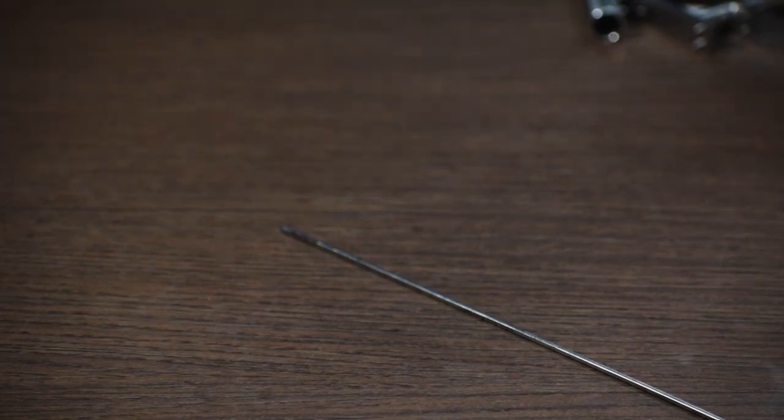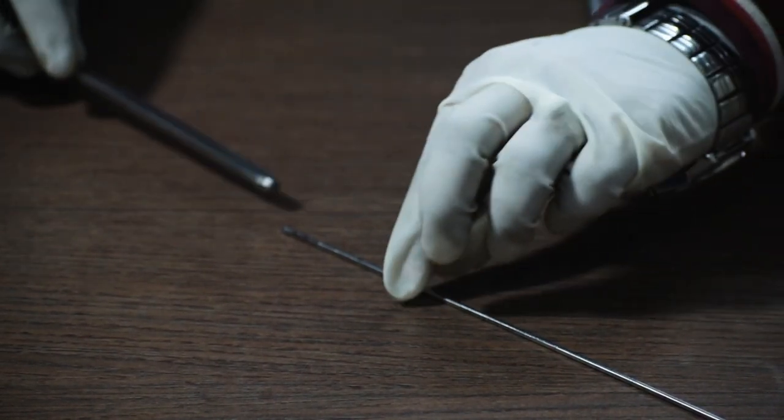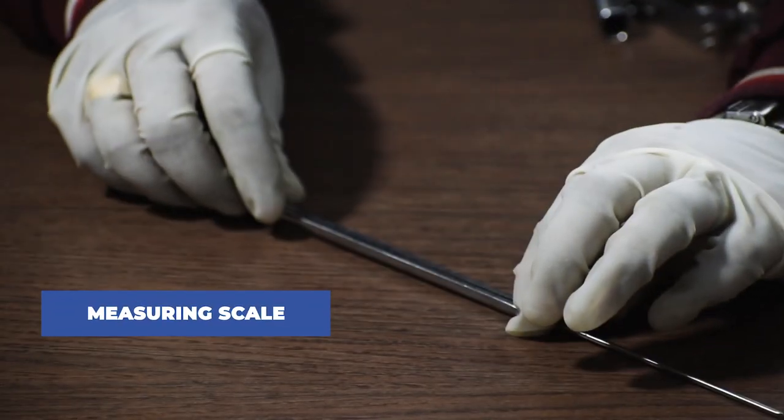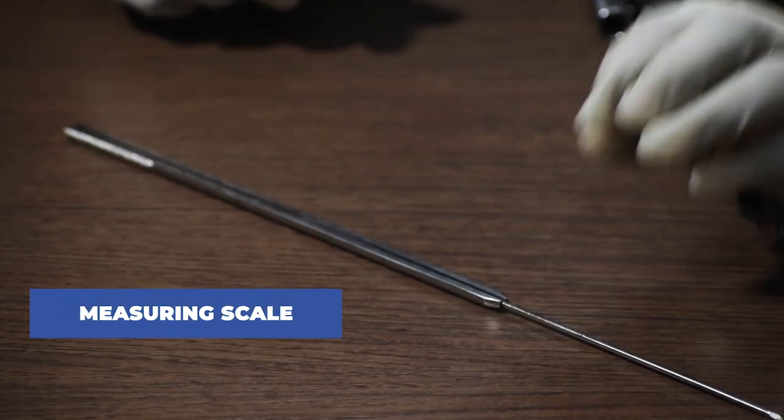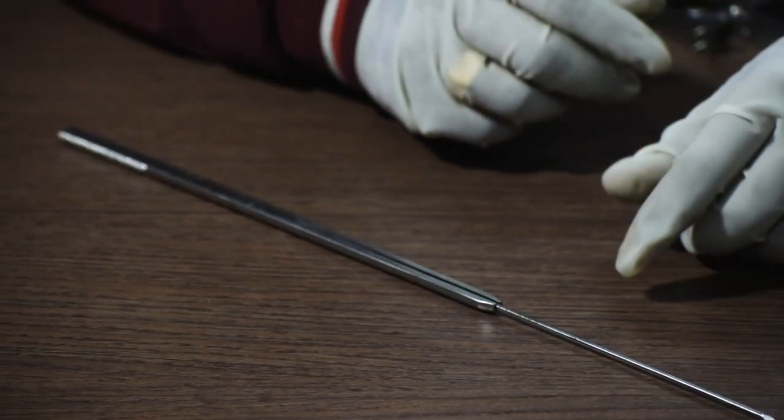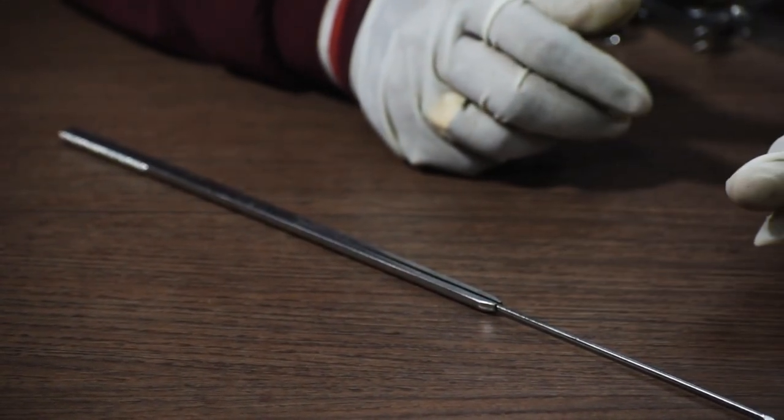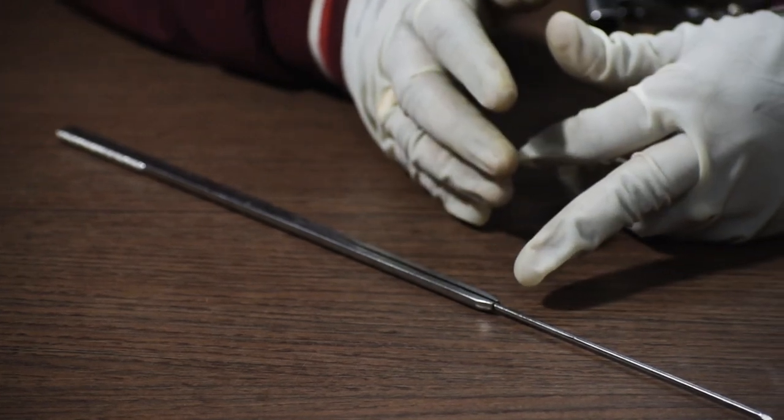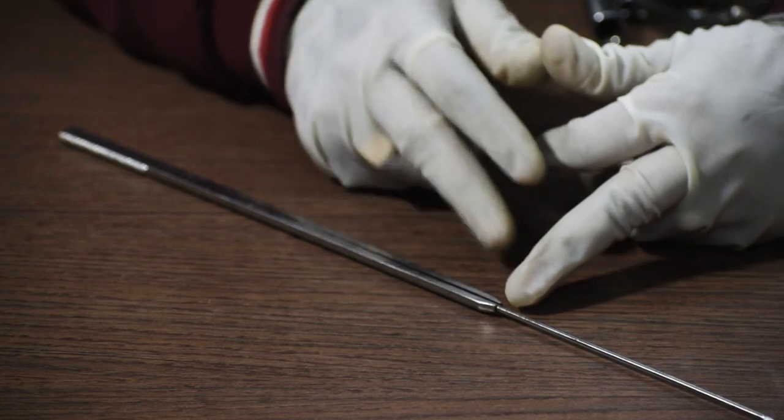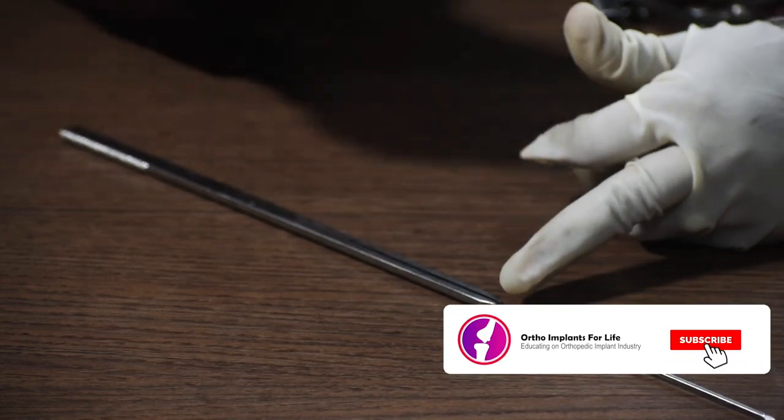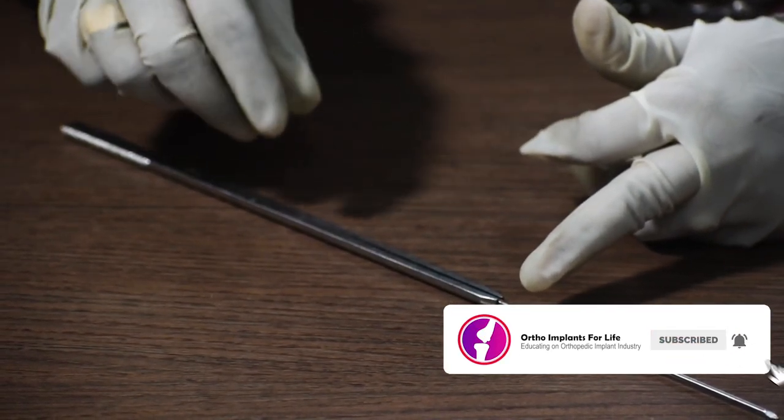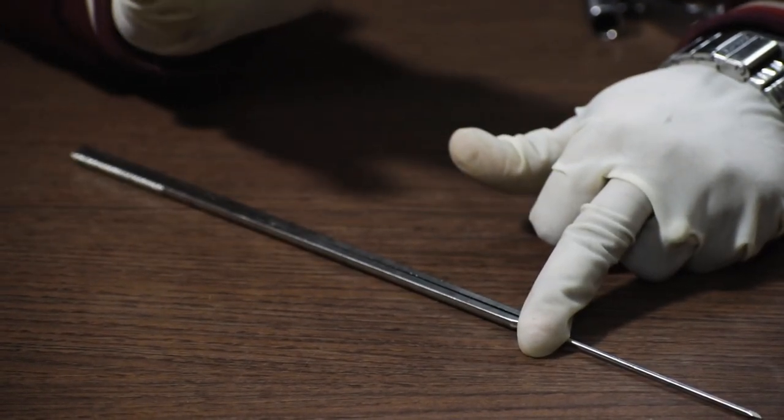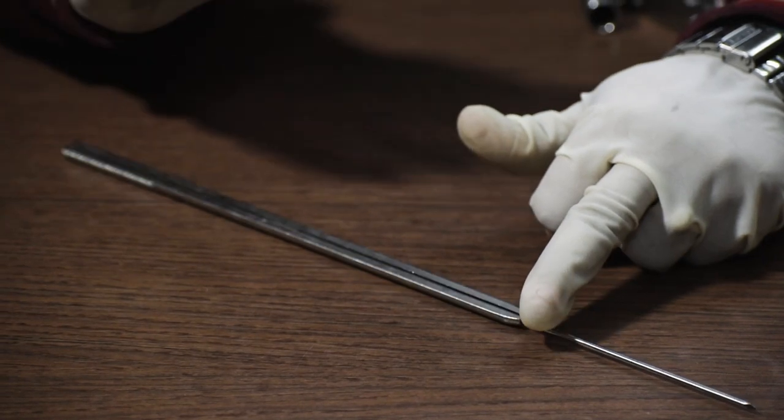After that we take the measurement with the help of a measuring scale. Now how do we take the measurement? The measuring scale will go inside and once the measuring scale touches the bone surface, we take the reading of the guide wire. As long as the measuring scale is touching the surface of the bone, it should give the proper reading for the measurement of the guide wire.